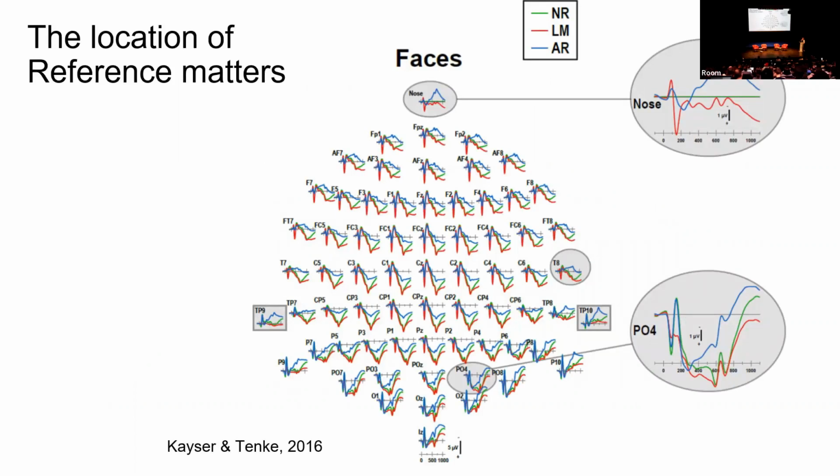It also changes the shape, the polarity, and the amplitude of your ERP.